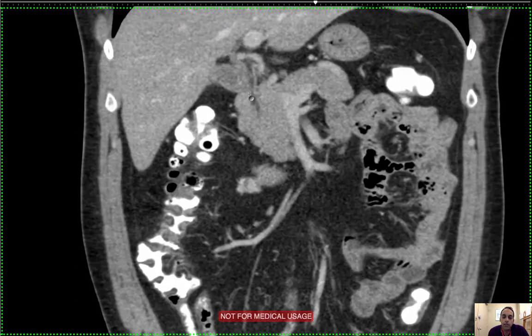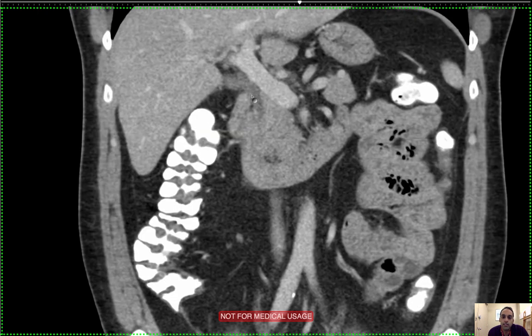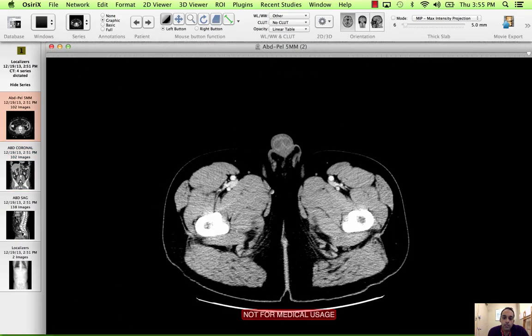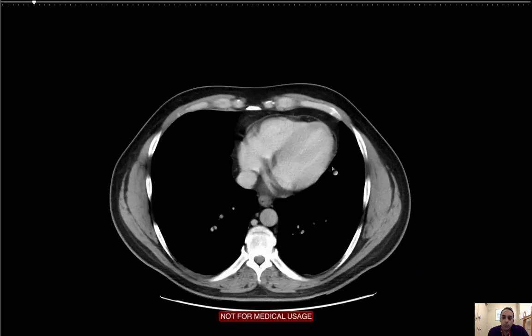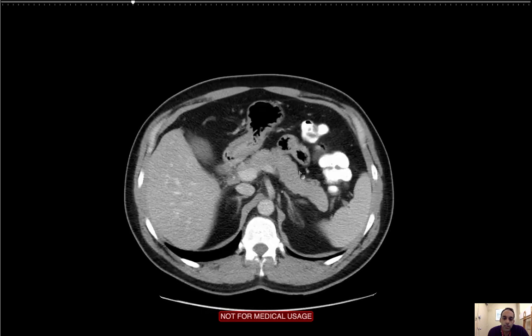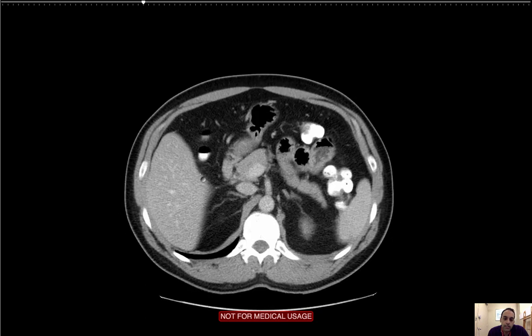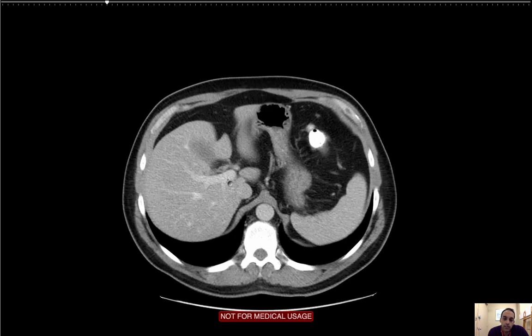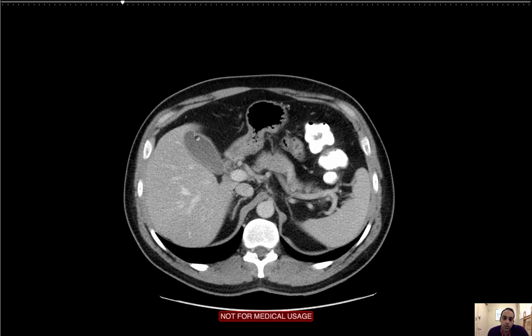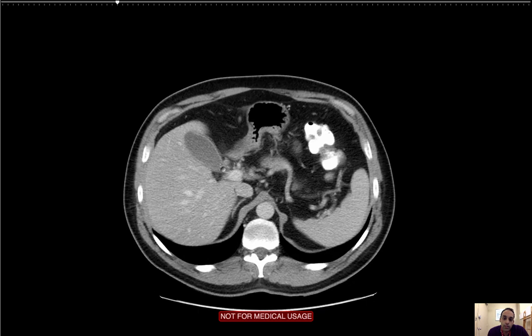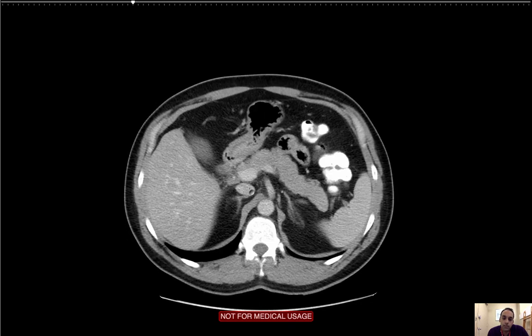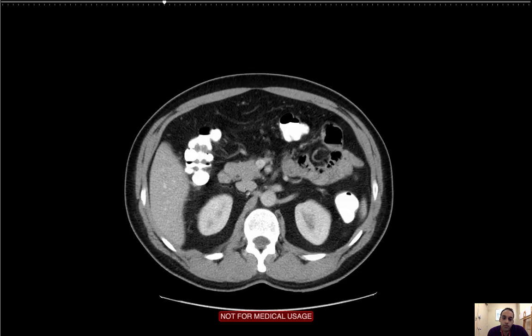While I'm here, I'm just going to look at the common bile duct. I can see it nicely in this plane — the common bile duct is not dilated. I'm also seeing the portal vein and the hepatic artery. Coming back to the axials, I'm also looking for intrahepatic biliary ductal dilatation — unless they're dilated I won't really see them. I'm looking to see if I see any dilated bile ducts running along the same distribution as the portal vein. Now I'm going to look at the gallbladder — is it enlarged, hydropic, are there any stones, is there evidence of acute cholecystitis with fluid or inflammation around the gallbladder? I'm not seeing any of that. So there's no evidence of acute cholecystitis, no intrahepatic ductal dilatation, no extrahepatic ductal dilatation, no focal liver lesions, and no evidence of cirrhosis or other diffuse disease.